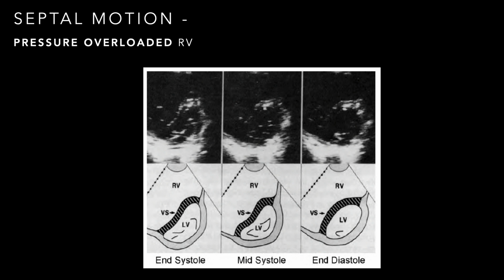But to comment accurately, it's important to slow the image down and look at your ECG and work out where you are in the cardiac cycle so that you can make an accurate comment about when the septal flattening is at its greatest or predominates.